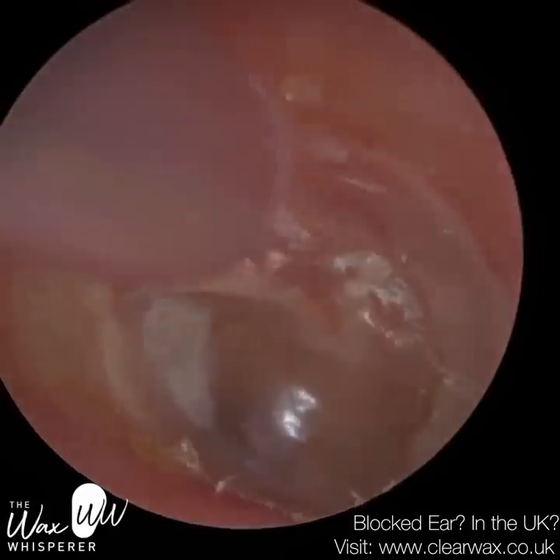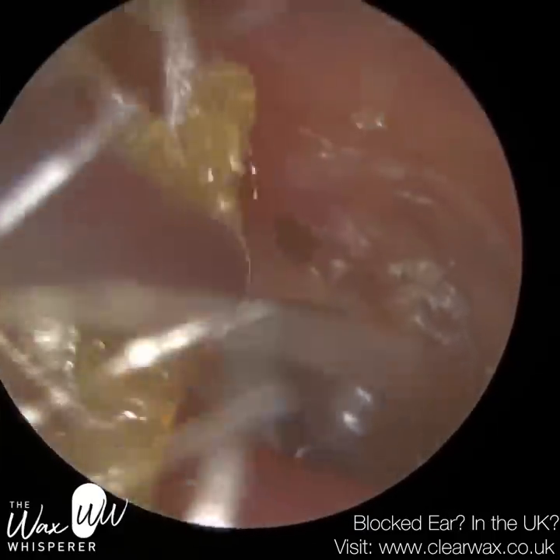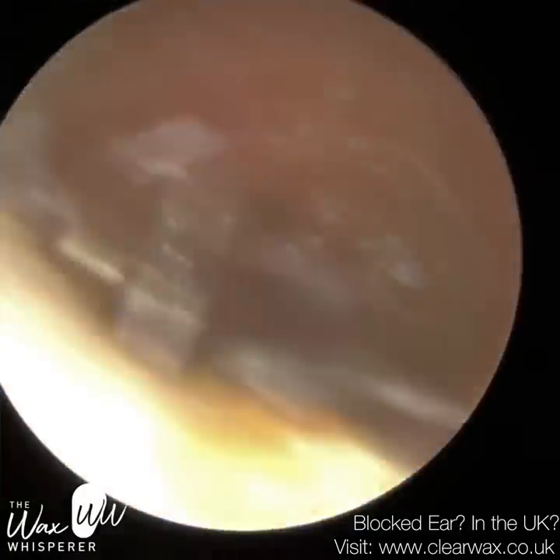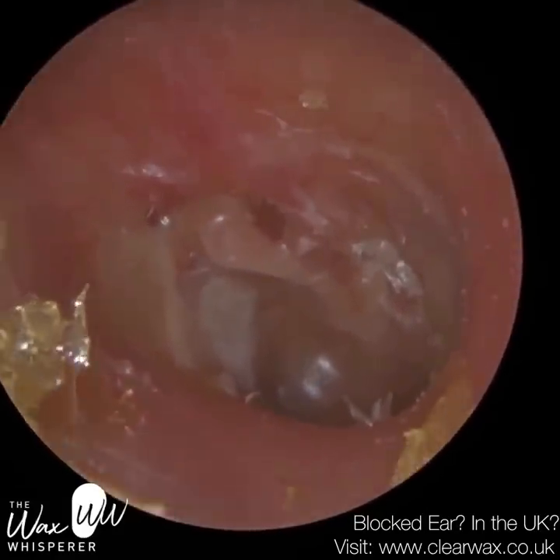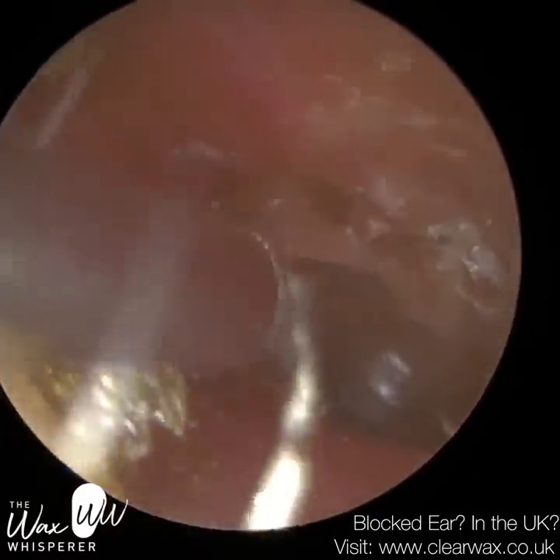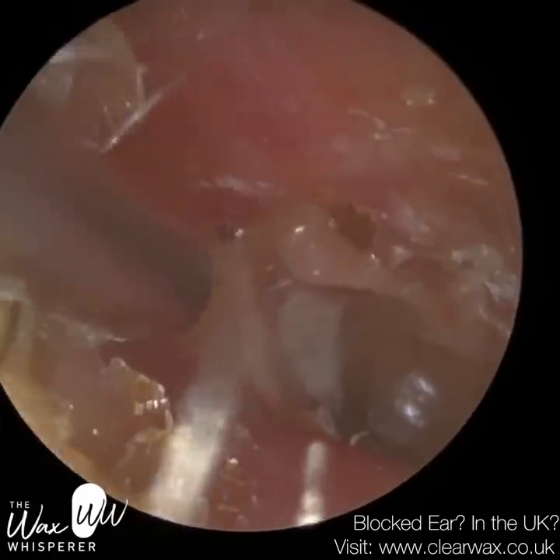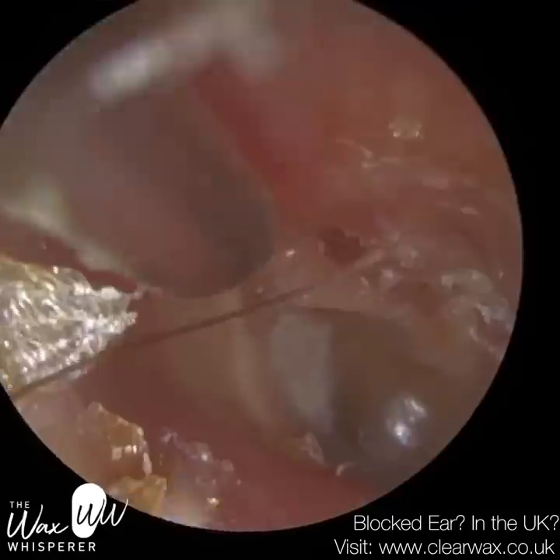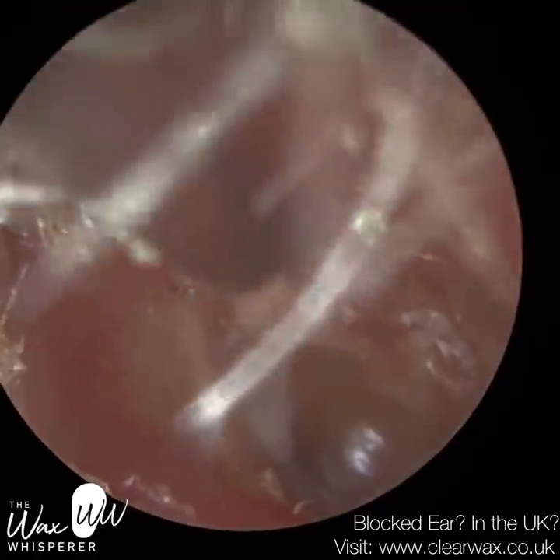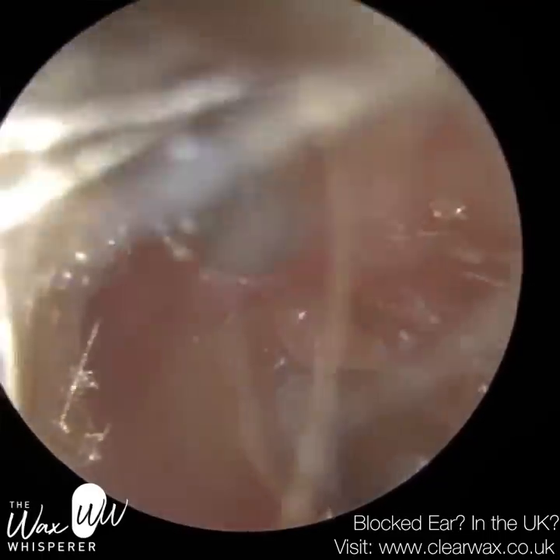I'm probably not going to get any more skin out there — just a bit of skin at the roof of the ear. So if that eustachian tube gets blocked for whatever reason — congestion, physical obstruction, or the muscles are weak and don't contract to allow air to equalize — the eardrum can get sucked inwards because all the remaining air in the middle ear gets absorbed by the cells of the mucosa, causing a vacuum, a cupping effect. It's the attic region and the posterior superior quadrant that are the most susceptible parts of the eardrum to get sucked in because they're the thinnest, most flaccid part.